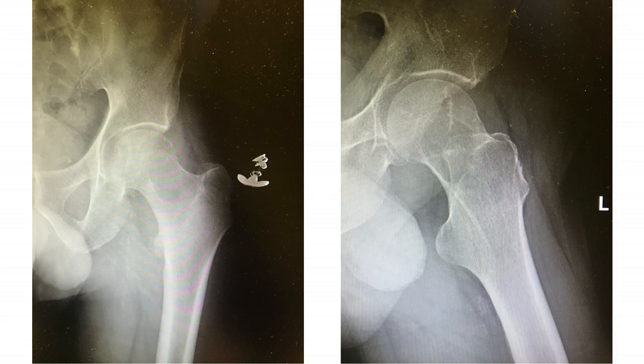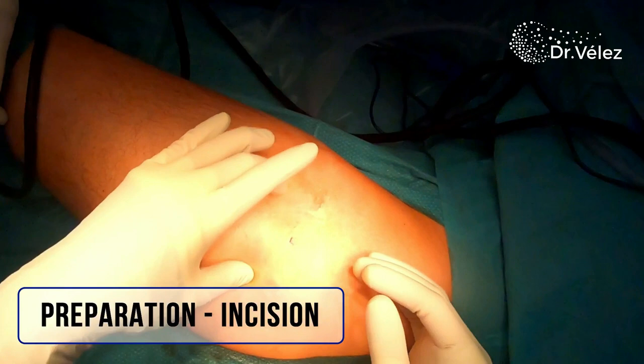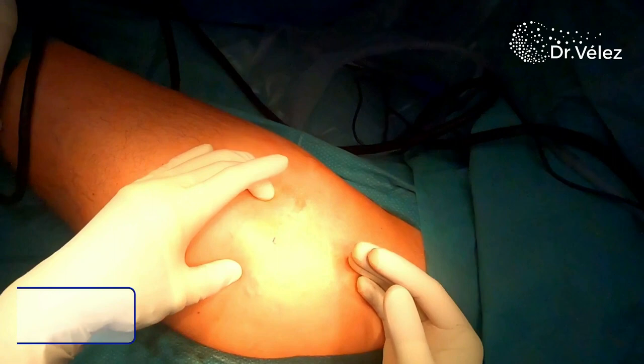So we propose to the patient a bipolar cemented hemiarthroplasty with two objectives: alleviate the pain and prevent a possible pathological fracture. So the technique you will see in the following video is a standard bipolar cemented hip hemiarthroplasty for a metastatic femoral neck lesion.